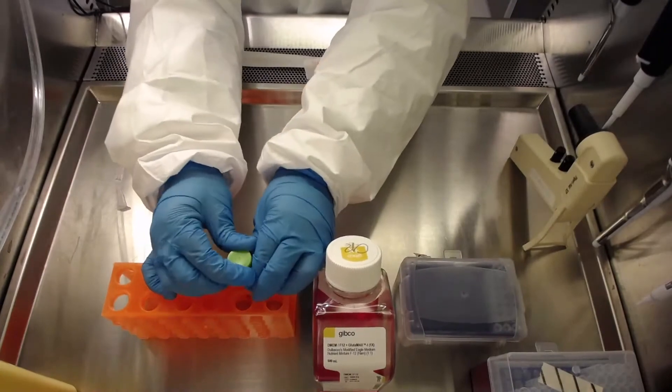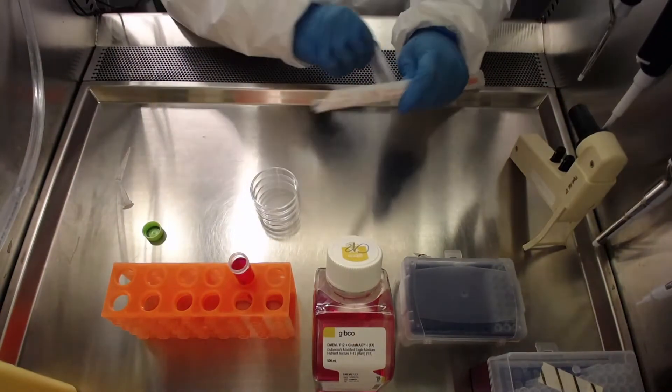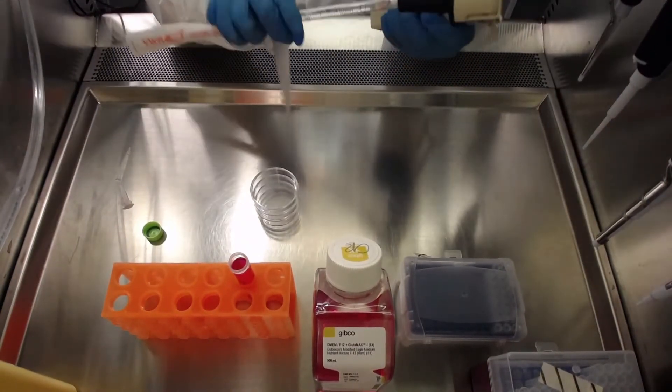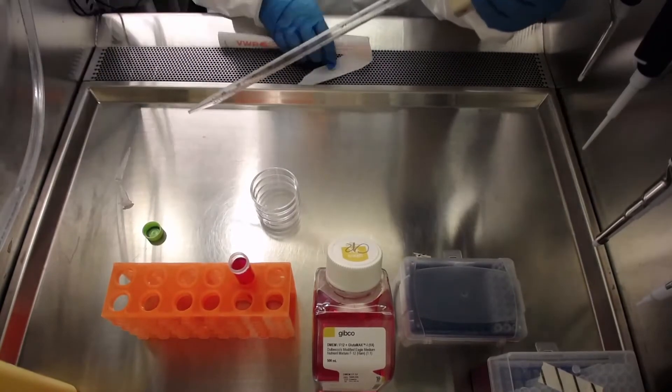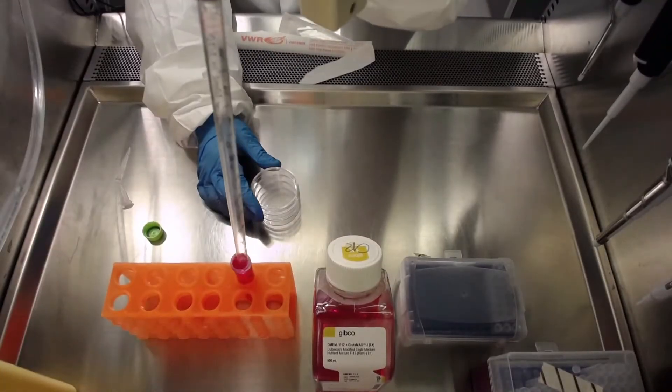Open the tube and using a sterile pipette transfer matrigel solution to the appropriate dish. In this case, we will add 2.5 ml per 6 cm dish.